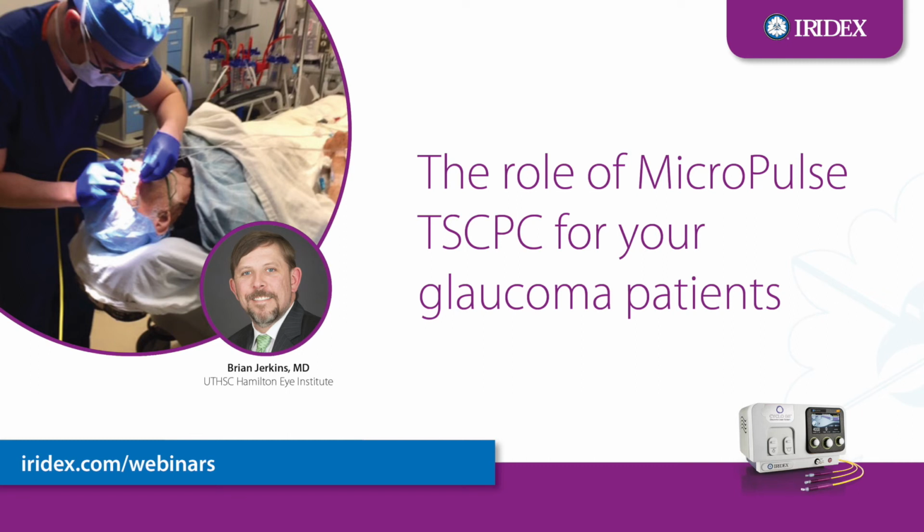No, I don't routinely do an OCT, and it's a great point. Maybe I should be, but I currently am not. Just in the same way, if I treat somebody with a prostaglandin, I'm generally not doing a pre-op OCT, but I am looking for reasons that they might have it. So if it's a prostaglandin patient and they've had an open capsule or some other trauma in the past or edema in the past, yes, I'll be a little bit more conservative with that.